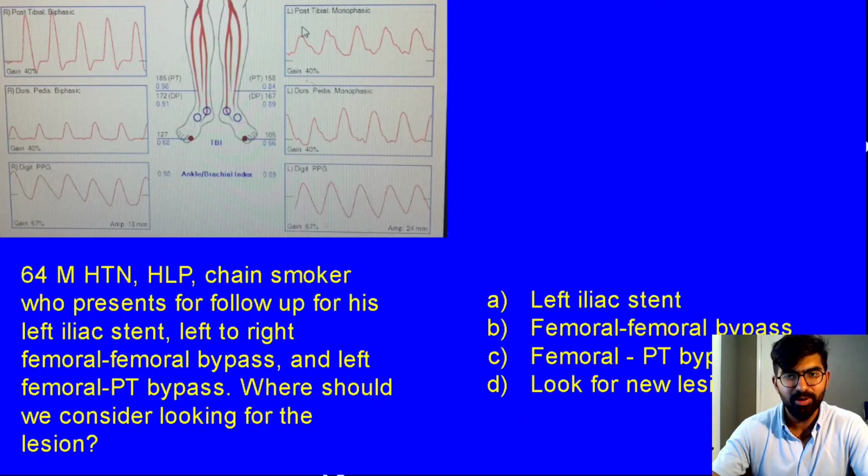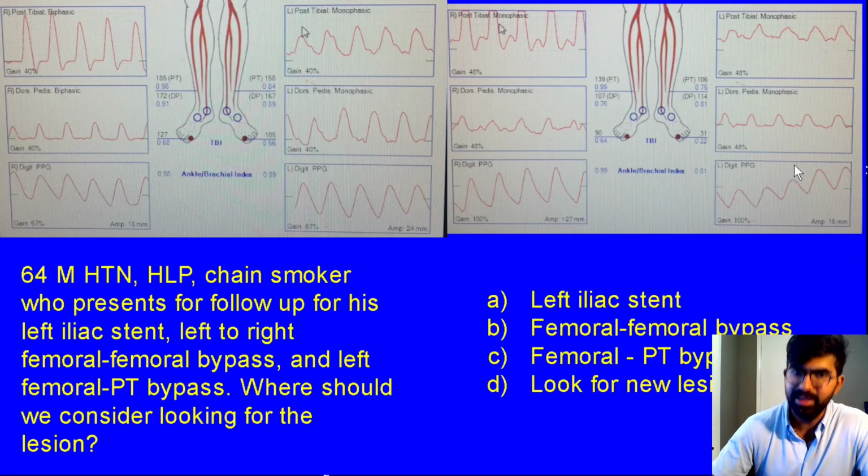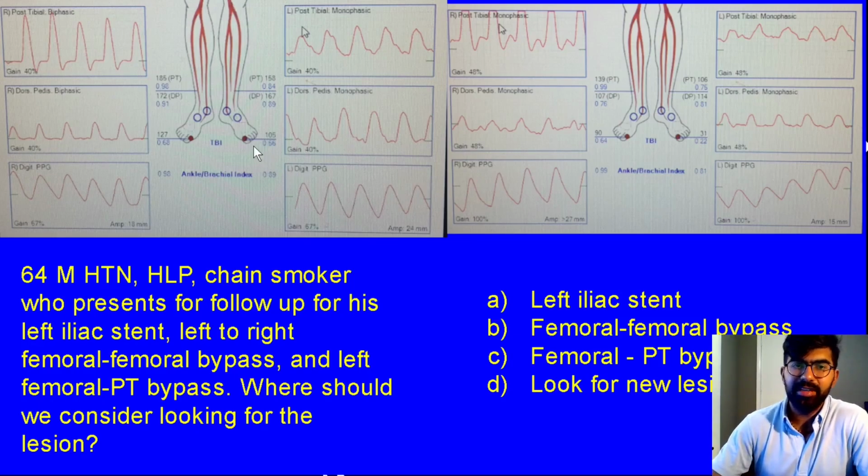So as we move forward with that patient we described, okay, so still the same guy, left inflow stent, left to right femoral bypass, and a left femoral PT bypass, okay? This patient, this is the surveillance scan, and he comes in afterwards with this, but asymptomatic. So let's look carefully at these studies, okay? And this is exciting. So you notice after revascularization, look at the toe pressure.